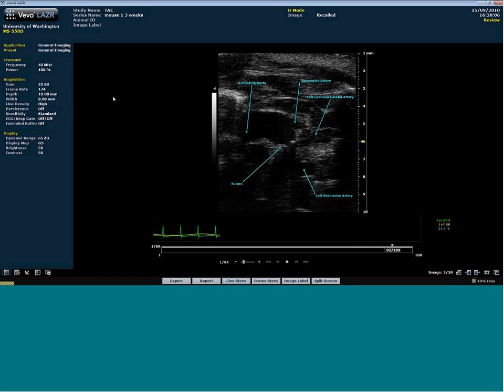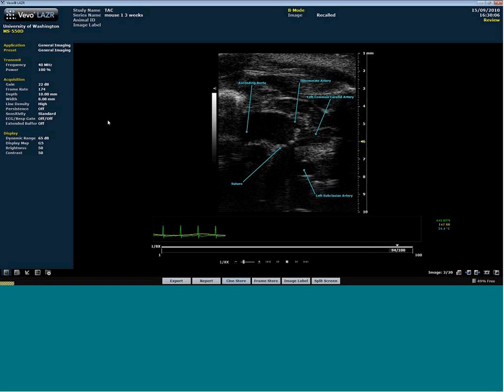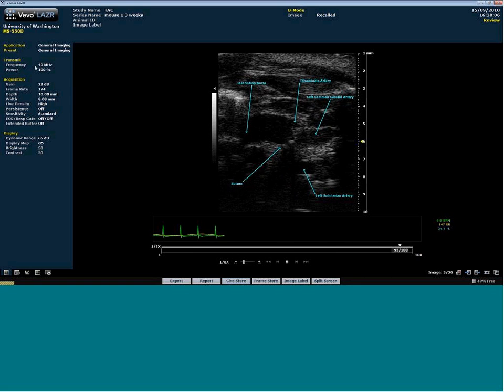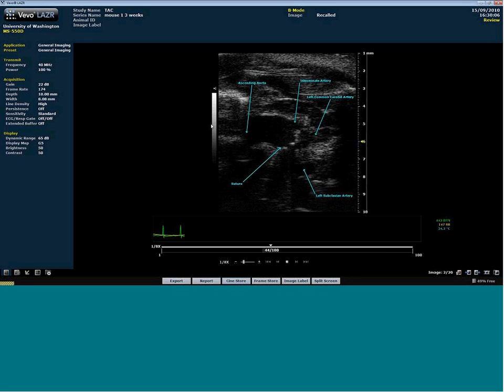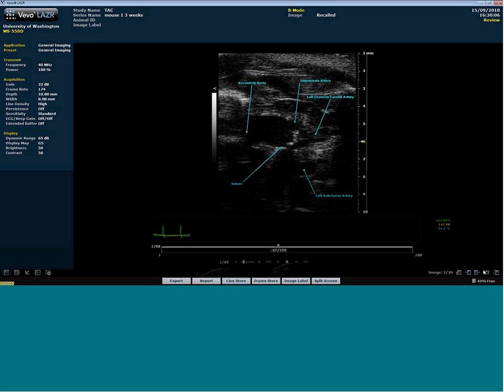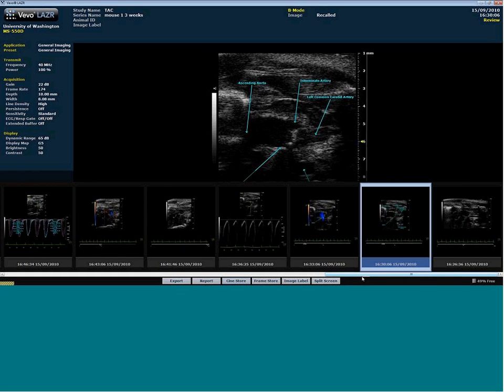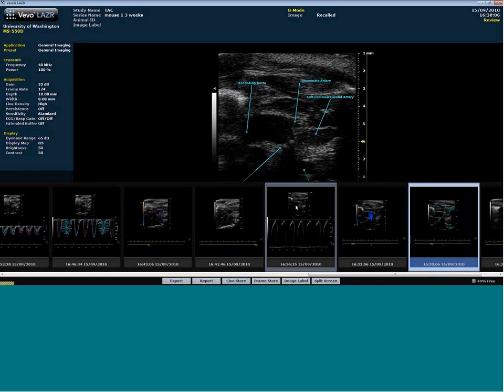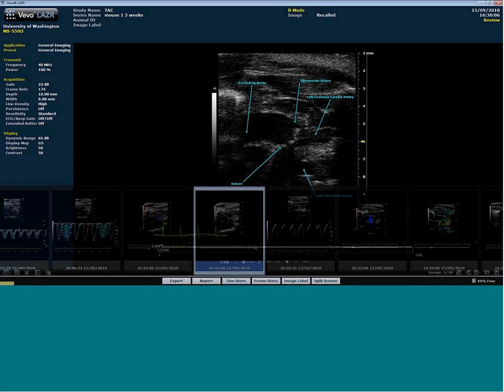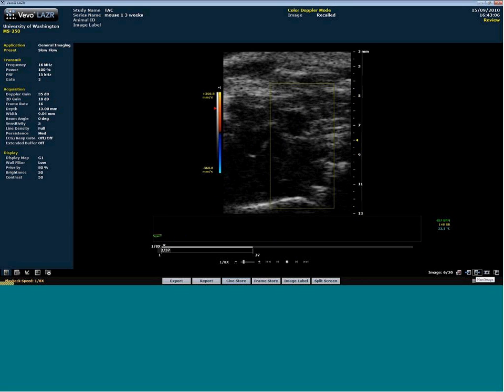So as you increase the frequency, the maximum speed of Doppler that you're going to be able to measure decreases. So if you're imaging models with a 550D, you're going to get really beautiful images of the aortic arch. You're going to get really beautiful images of the left ventricle, but the maximum velocity that you're going to be able to measure up to with Doppler is not necessarily high enough to get to where you need, in terms of what the flows are.